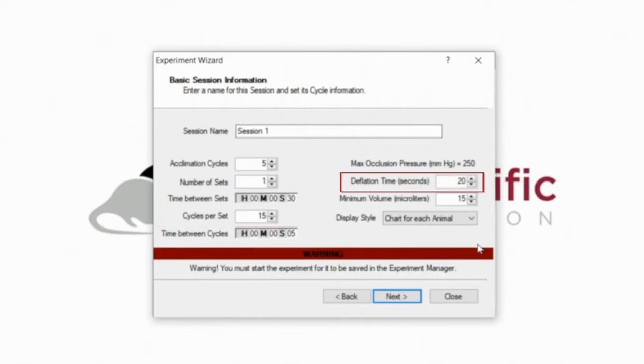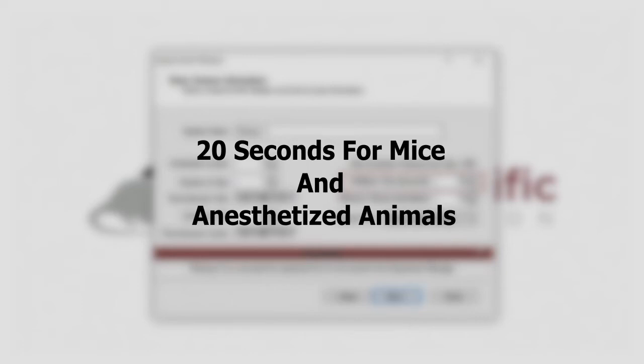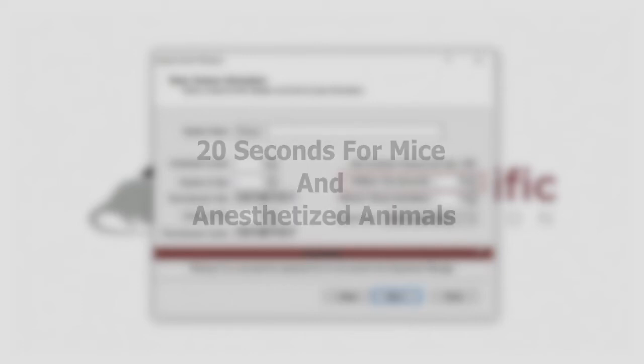Deflation time is an important setting, as it affects the sensitivity of your measurements. Select a deflation time of 20 seconds if you are using mice or if your animals are anesthetized, and a deflation time of 15 seconds for conscious rats.